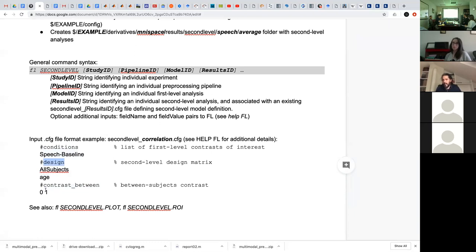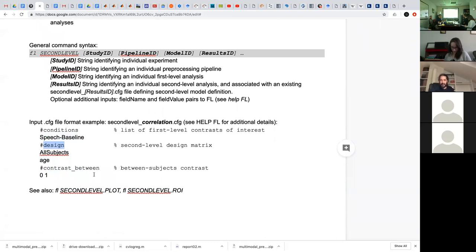Are you familiar with this, or do you want me to go back to that original talk and go into all of this in a little bit more detail? I think it would be good to circle back. Maybe we could just go through what this is supposed to look like. But my next question, if we just put aside the idea of circling back, is: can we just look at an example of what these are?